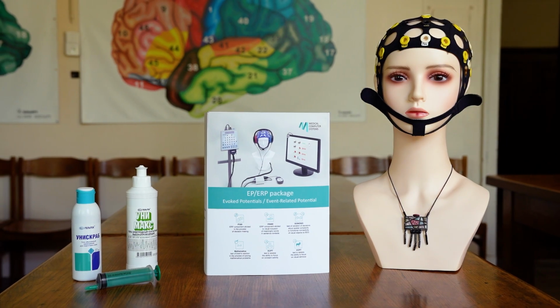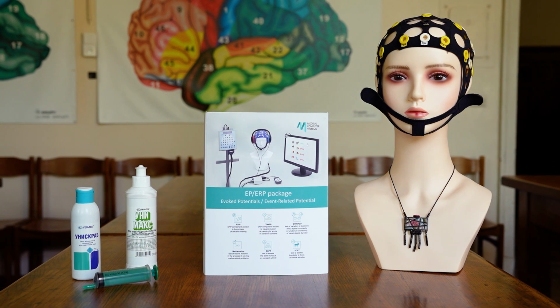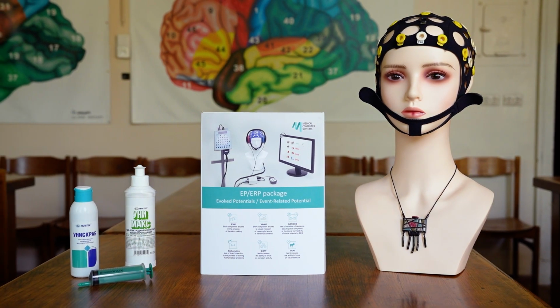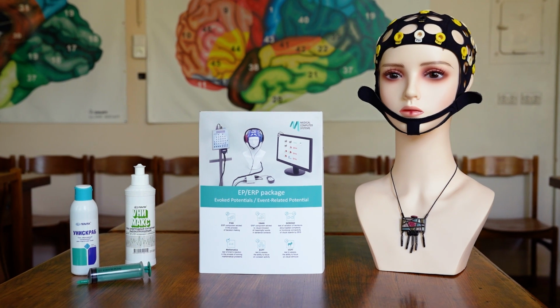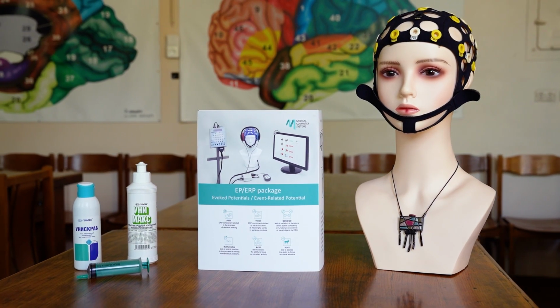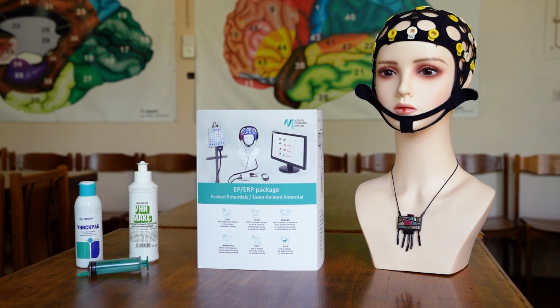The process of electrode placement has been discussed in detail in previous lectures. Now we would like to draw your attention to the fact that abrasive gel has proven to be very effective. It allows you to reduce the transient resistance between the electrode and the skin significantly and achieve good contact.